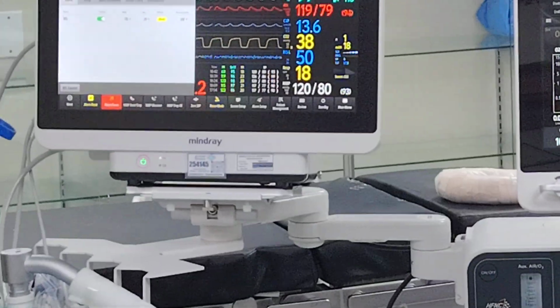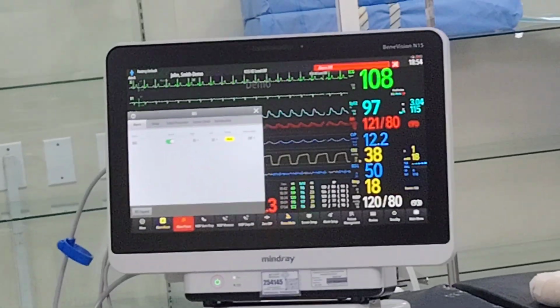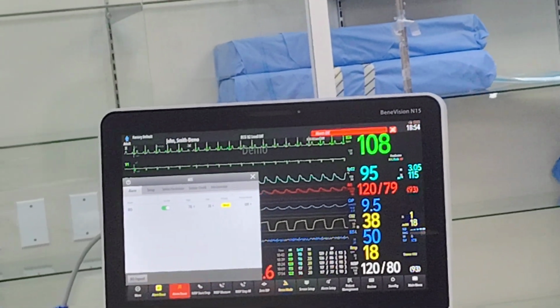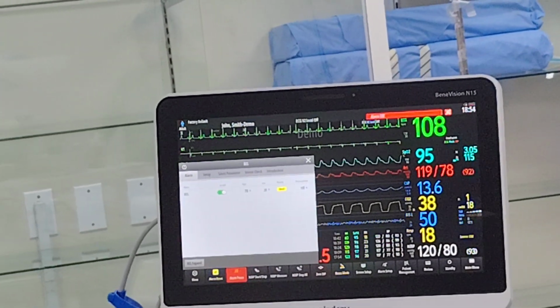But I will tell you one thing. The most important thing, or the common mistake that I've seen, is that people forget to clean the forehead. You have oil sometimes, right? So always wipe it with alcohol, wait for it to dry, and then put it on.